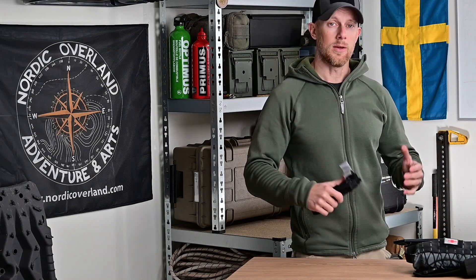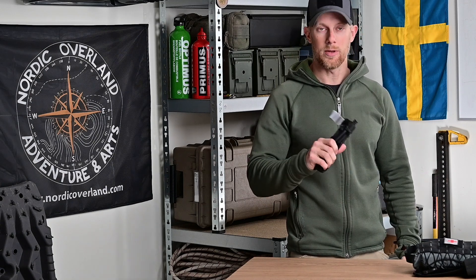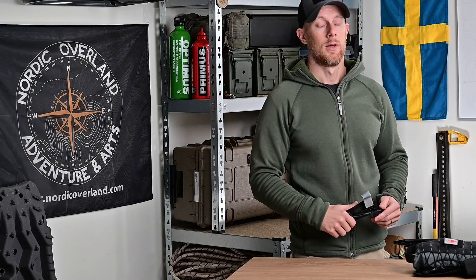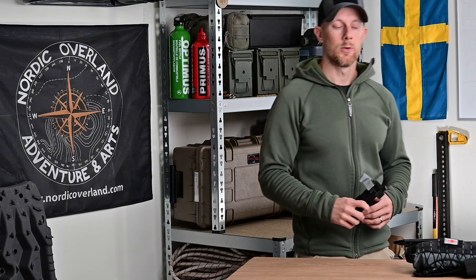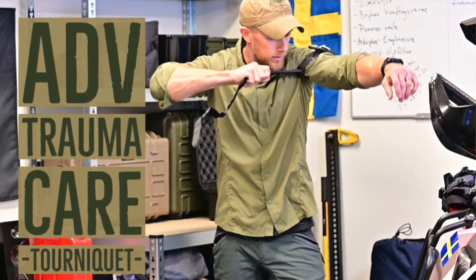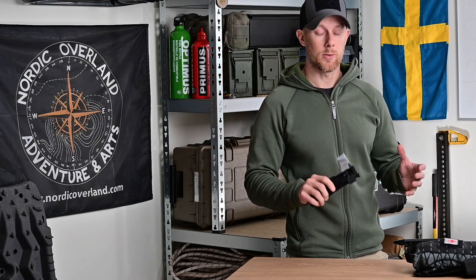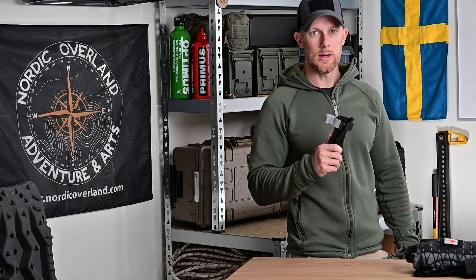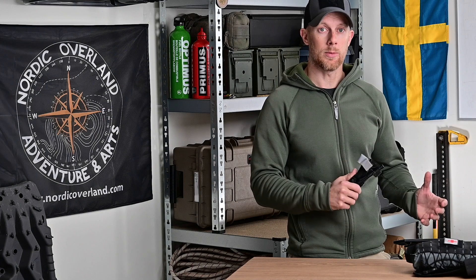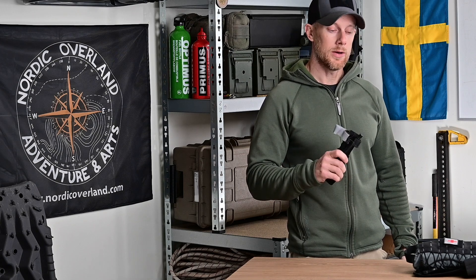Den metoden har jag förevisat i ett annat klipp, titta gärna på den också för att bekanta dig med den. Jag har också en äldre video där jag går igenom alla delar om tonikén och dess applikation. Det här klippet handlar mer om att ge tips och tricks för hur du riggar tonikén och dess bärande för att kunna applicera den så snabbt som möjligt på dig själv eller din kamrat vid en artärblödning.